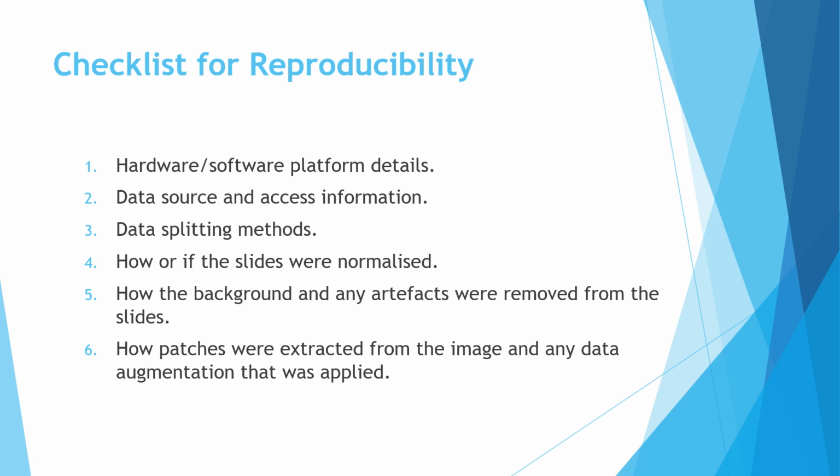So different type of stains may have been used in those images that results in a kind of variation in intensity of the image. So some normalization may be necessary for the slides prior to training the model.